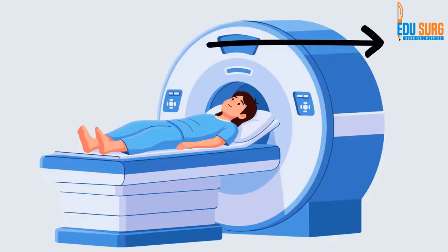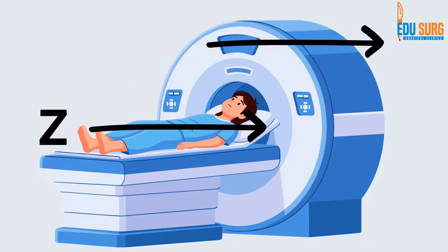So you see here that once the patient goes inside the machine, the external magnetic field is applied in the direction of this black arrow, and then the patient's magnetic field will also align with this magnetic field, that is the external magnetic field. So MRI, the concept of M is over here. There is a magnet in the MRI of the strength 1.5 Tesla or 3 Tesla or whatever your machine strength is. And this magnet intends to do proton alignment so that the current in the body is in the direction of the external magnetic field.